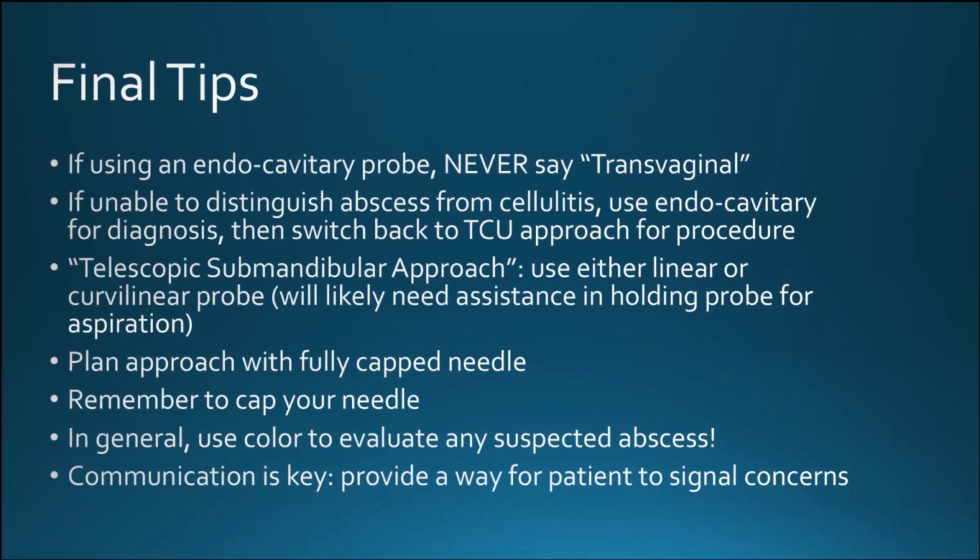And so, like I said, they coined this as the telescopic submandibular. You can use either a linear or curvilinear. Likely, you will need assistance with this. You'll need somebody holding the probe. They did say that probably after a little bit of practice you may be able to do it yourself. But that's if you don't need some other tools to help keep the mouth open or the tongue out of the way while you're inserting the needle for the aspiration.